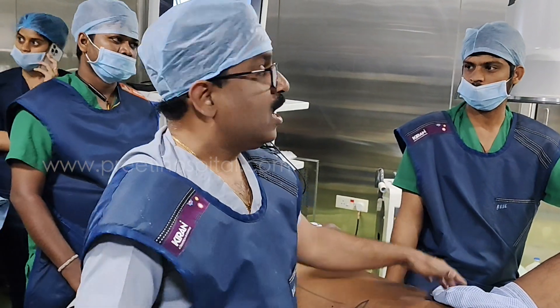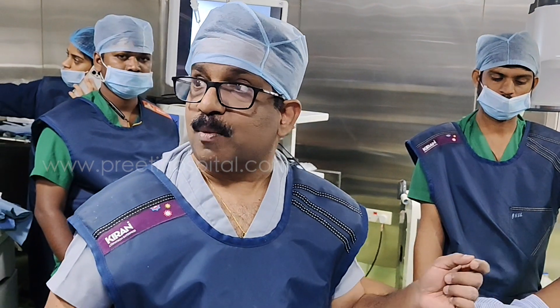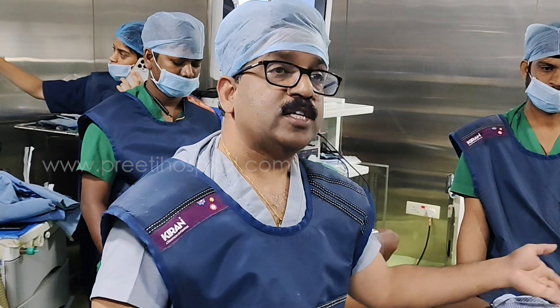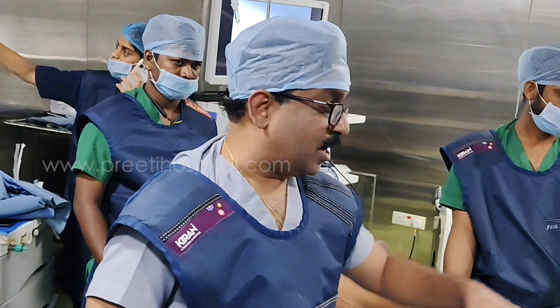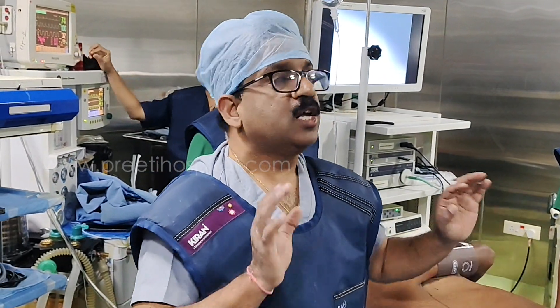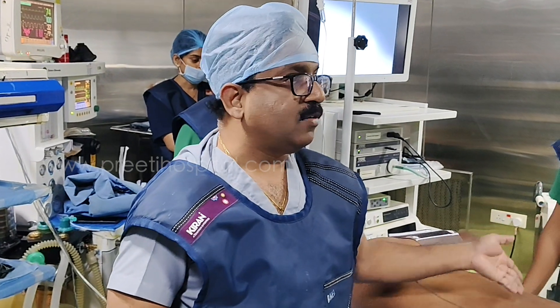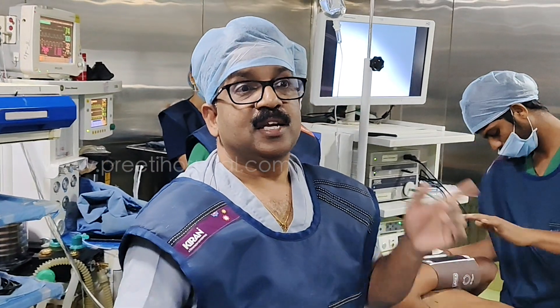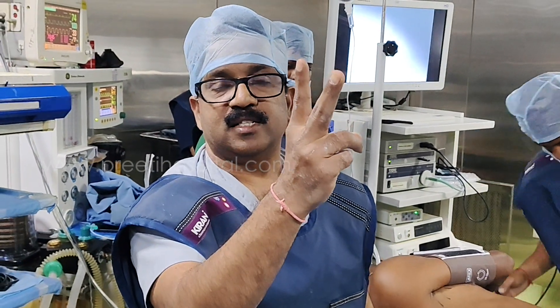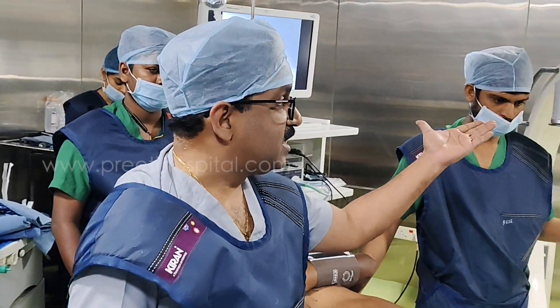The true ECIRS indication is when there are stones in different calices — for example a small stone above a big stone. The PCNL surgeon handles the big stone while the flexible ureteroscopy person uses a 6.3 French scope — not even an access sheath — goes inside, sees the small stone, baskets it, and passes it out. If there is only one stone, there is no need for ECIRS. Two stones in different calices — then ECIRS, so you need not make another puncture.